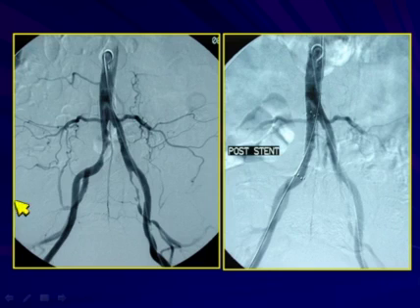You can see the lesion here on angiogram, and this was addressed with a stent and repaired. His graft was fine afterwards, and since this was threatening his graft, it was good that this was identified early and repaired prior to him losing that very nice vein graft.